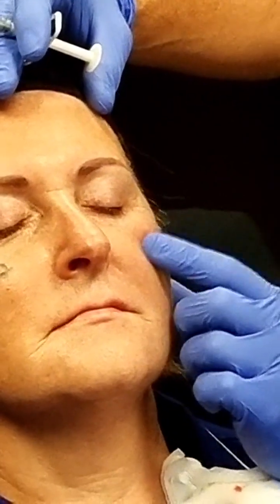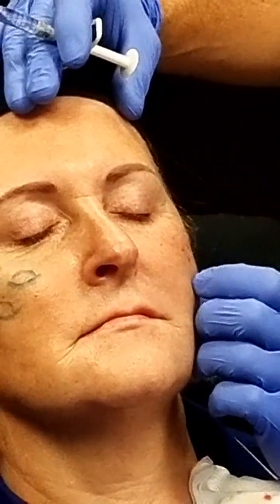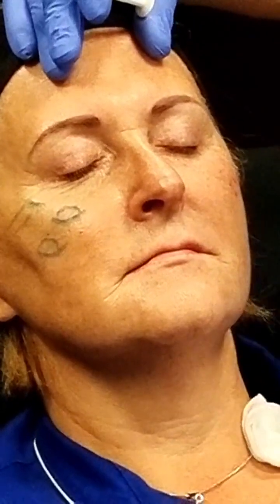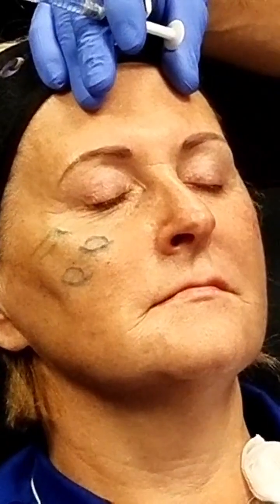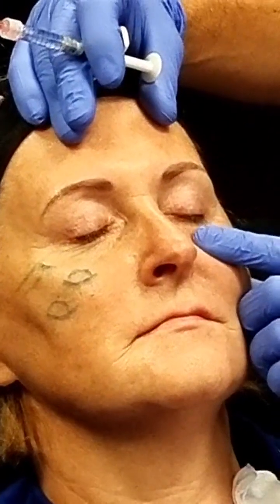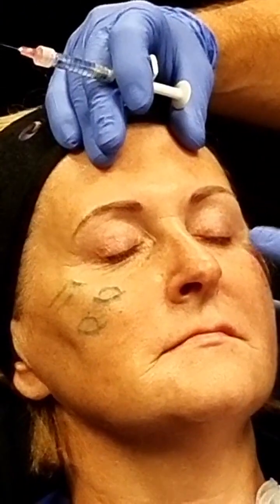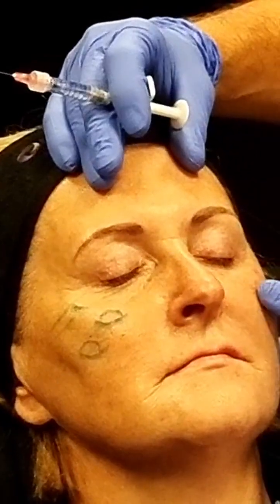So you're leaving the product with a bolus technique? Yes, this is a bolus. You feel a hole, you fill it with a bolus, and you might massage it into something that resembles a UFO even, but that's about it.